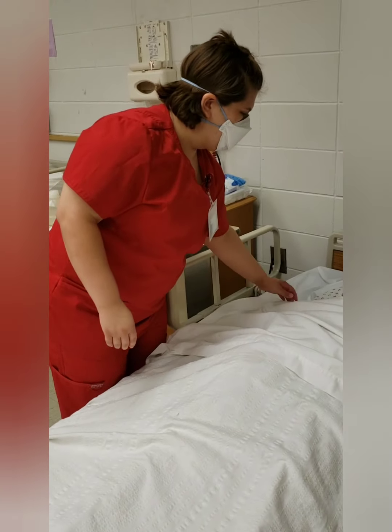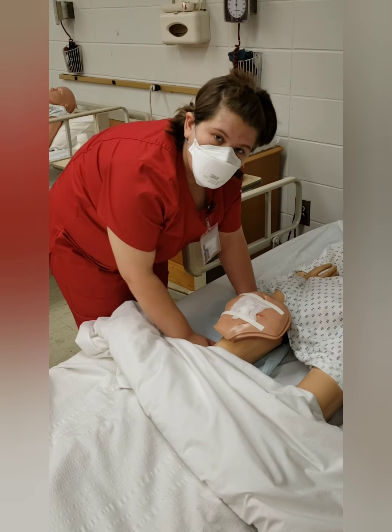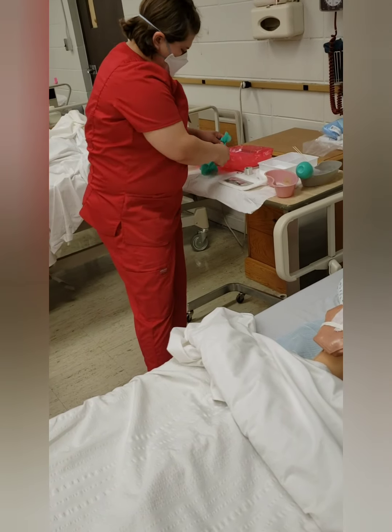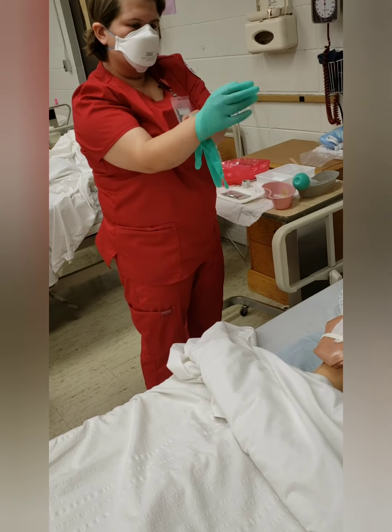I am going to close the curtain for your privacy. And I'm going to pull back your blanket to only expose your wound. I'm going to place a sheet under you so we don't soil your linens. Alright, I'm going to apply clean gloves.